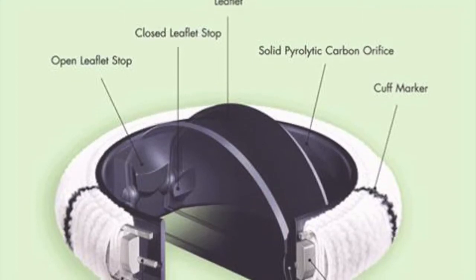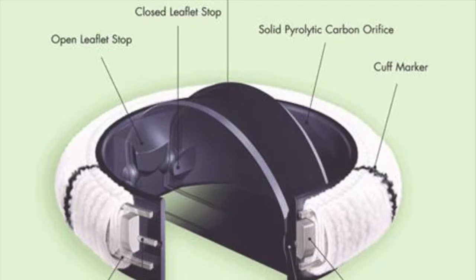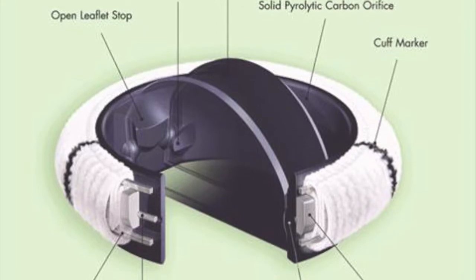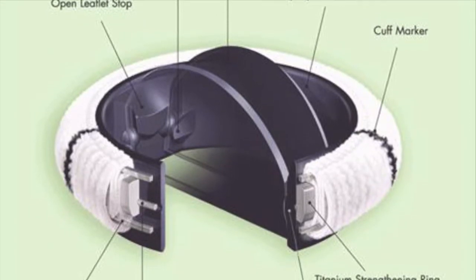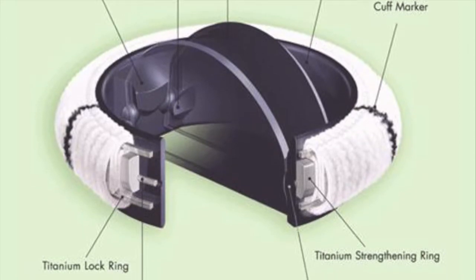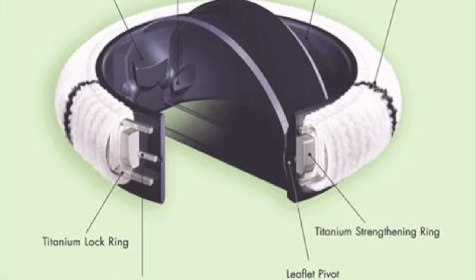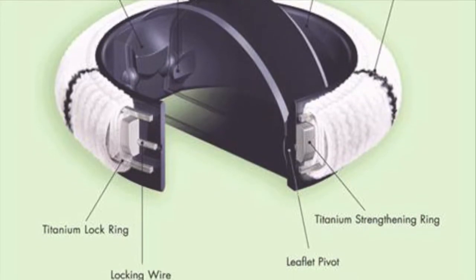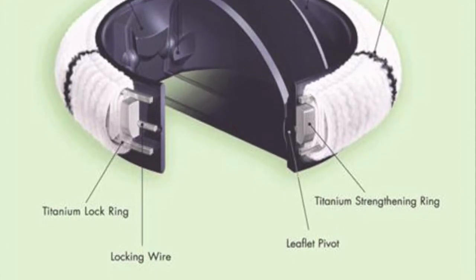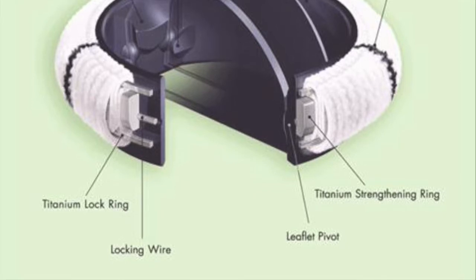There are different types of materials used in creating mechanical valves. Pyrolytic carbon is considered one of the most valuable materials for mechanical valves for its strength and its clotting prevention. It is biocompatible and thromboresistant, also known as blood clotting resistant. It's also resistant to wear and has high durability. It can withstand constant opening and closing cycles, which is one of the sole purposes for mechanical heart valves. Bileaflets are especially known for using pyrolytic carbon.